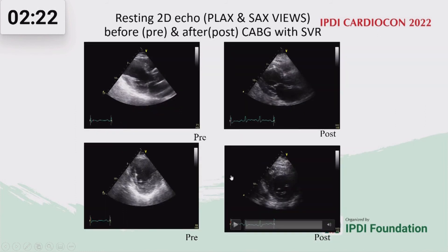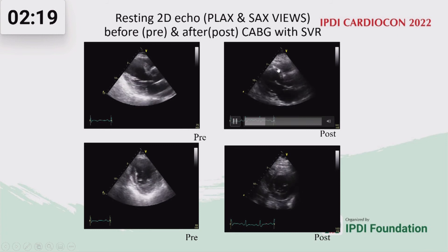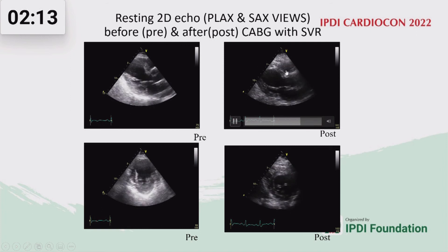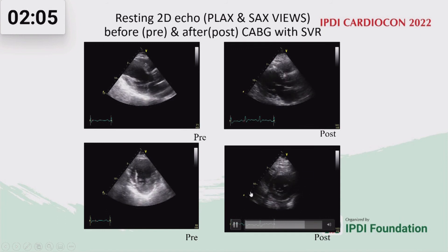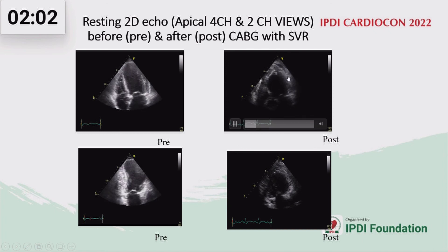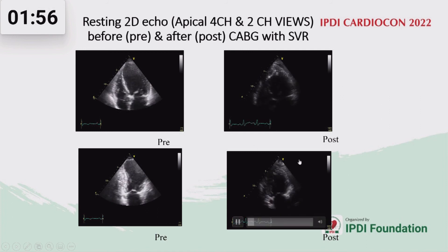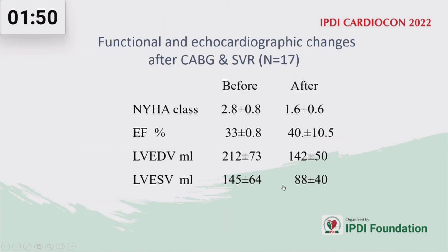This patient underwent SVR. The SVR patch (white patch) excludes non-viable segments and reduces LV size. After SVR and CABG, the short-axis view shows the LV becoming more rounded. Four-chamber and two-chamber views after CABG and SVR demonstrate placement of the SVR patch, reduction of LV end-diastolic volume, and improved wall motion and contractility. In this group, functional class, ejection fraction improved and end-diastolic and end-systolic volumes reduced.